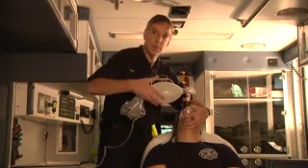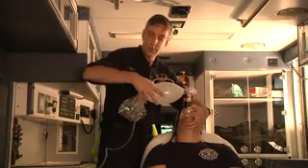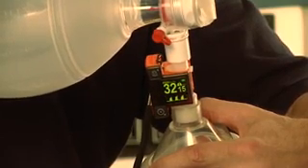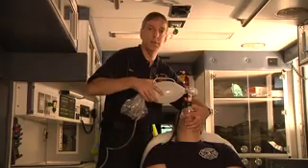If the patient's breathing spontaneously, holding the bag valve mask over their face allows them to draw 100% oxygen from the bag, and you may need to adjust the flow of the oxygen so that the bag delivers 100% oxygen to the patient without totally collapsing with each breath.